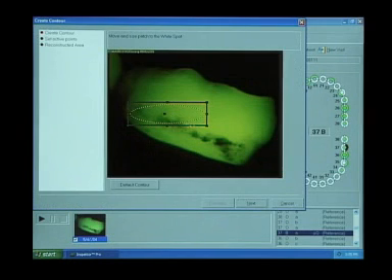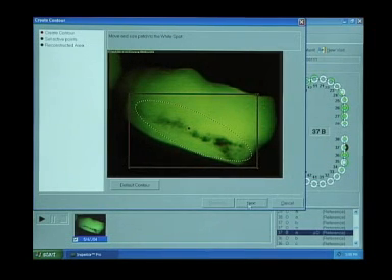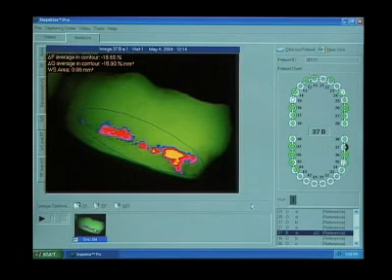Because the fluorescence emanates from behind the enamel, it is as if the tooth is illuminated with a green light source from within. Any anomalies in the enamel, such as demineralizations, show up as dark gray areas, because the anomalies are less transparent and cause fluorescence loss. This fluorescence loss is directly related to the lesion depth and mineral loss, and can be quantified with the Inspector Pro analysis software.